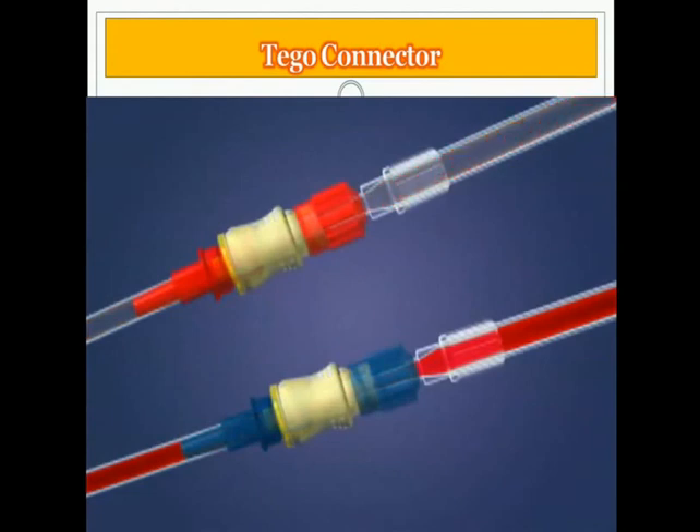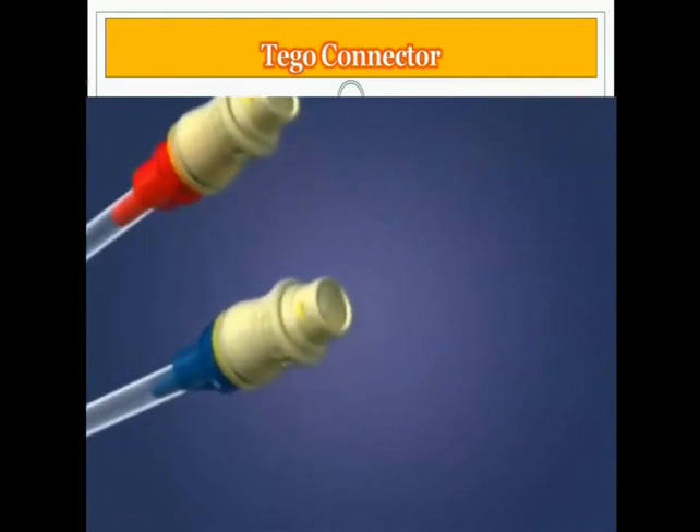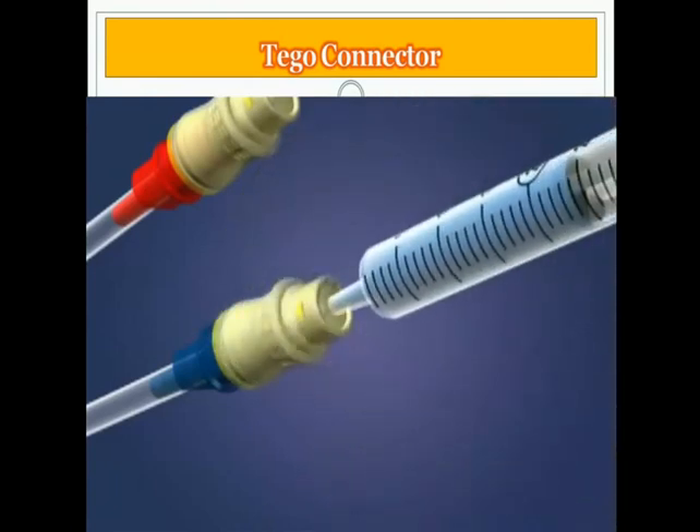After the treatment is complete, disconnect the bloodline by grasping the TAGO and twisting the bloodline away until loose. Next, the TAGO and catheter should be flushed according to your facility protocol. Swab the top of the TAGO and attach the flush syringe.